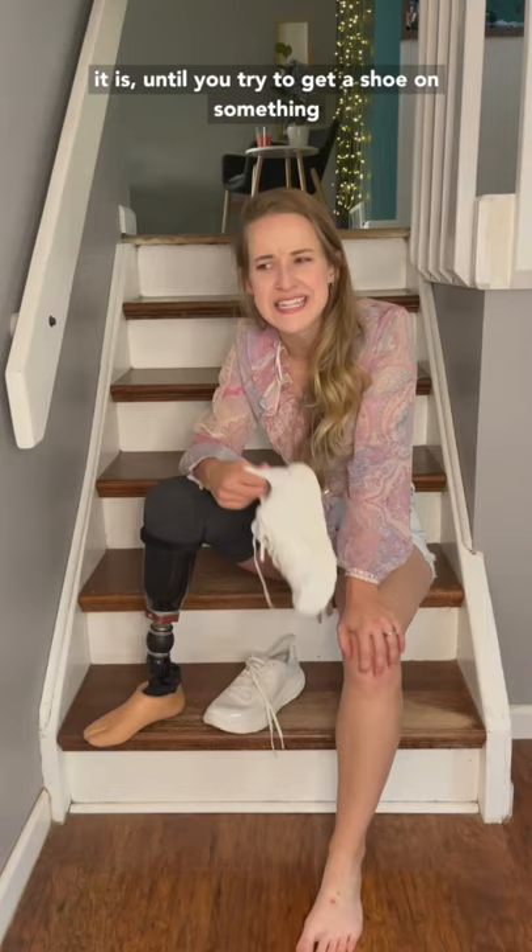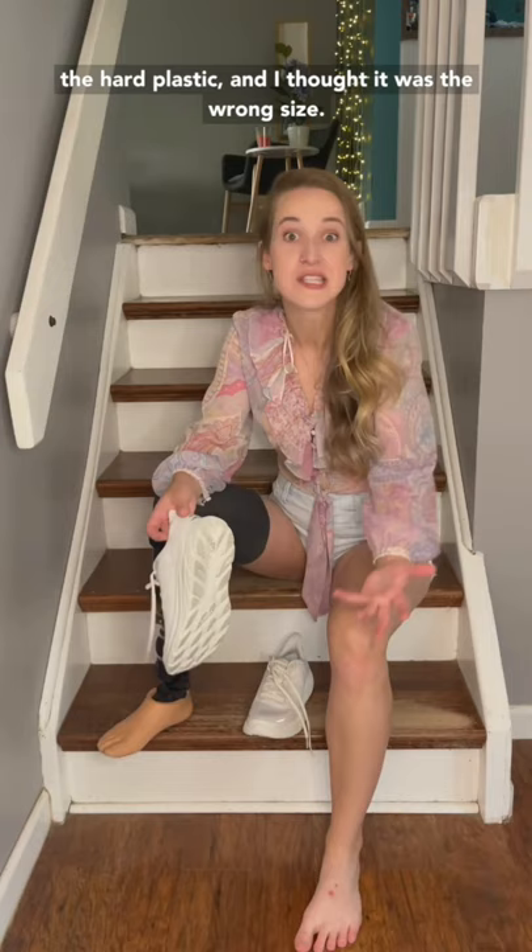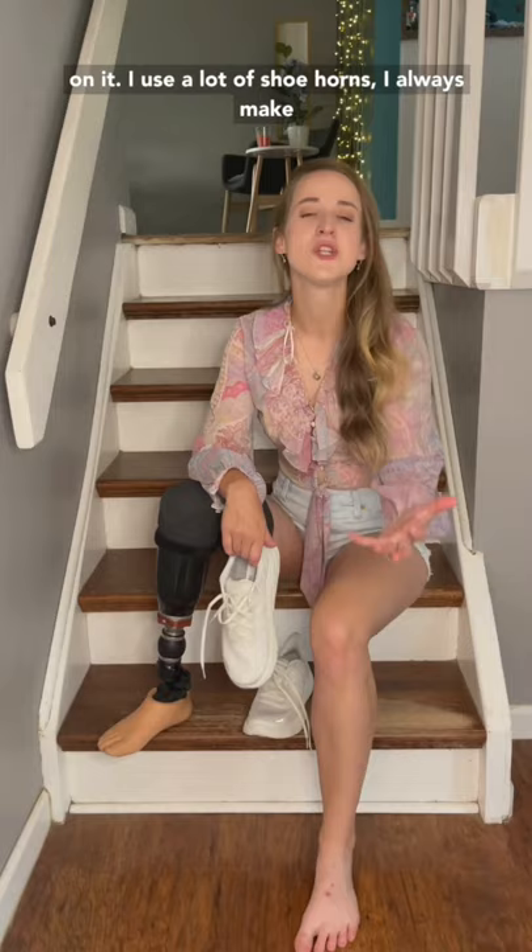When I first started using my prosthetic and trying to get shoes on, it was so difficult to get around the hard plastic that I thought it was the wrong size. In fact, it turns out you just have to use a little more muscle when you're getting shoes on. I use a lot of shoe horns. I always make sure there's a sock on my prosthetic foot to kind of reduce some of that friction.